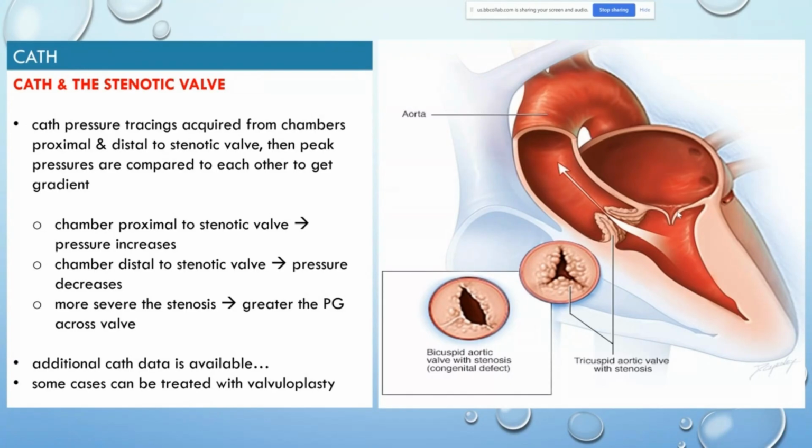Sometimes this valvuloplasty can be called valvulotomy. Sorry, I never pronounced that right. It widens the heart valve that is narrowed, and the valve has to be pliable. You can't use it for valves that have a bunch of plaque on them. If the valve was just smaller and you're prying it open and it doesn't have calcifications, you can use it. If it has calcifications, you cannot use valvuloplasty at all.